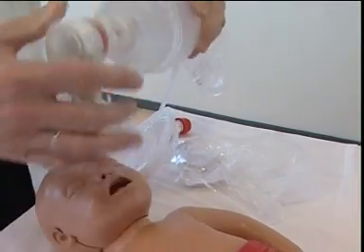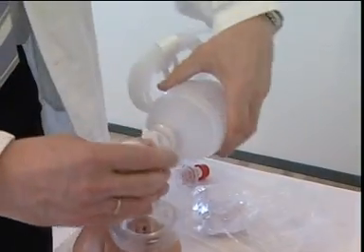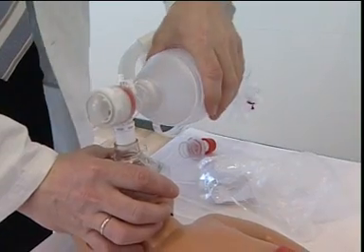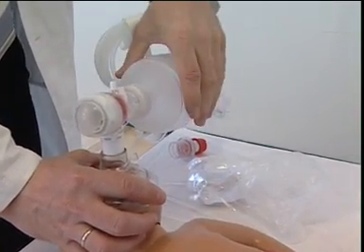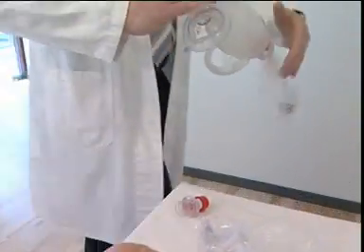To ensure a better grip, the SPUR II Adult and the SPUR II Pediatric are equipped with a handle. If needed, the handle can be turned away by holding the patient valve with one hand and turning the handle away with the other.